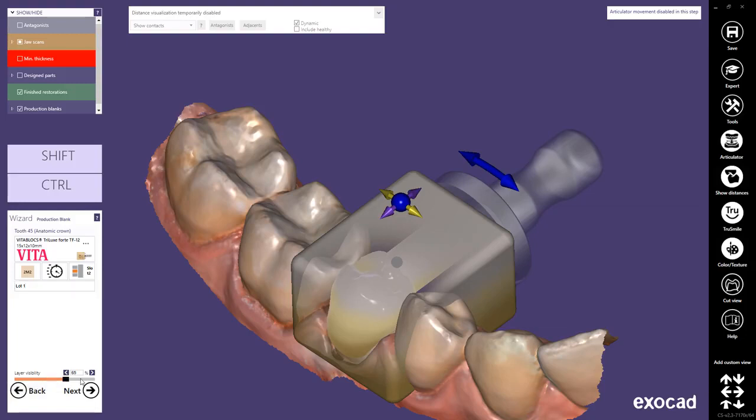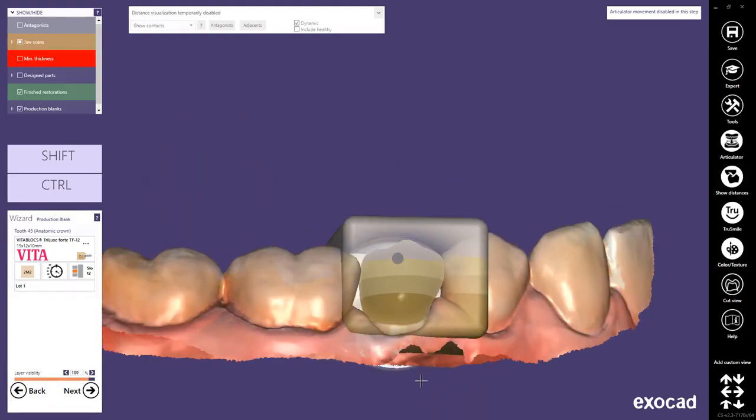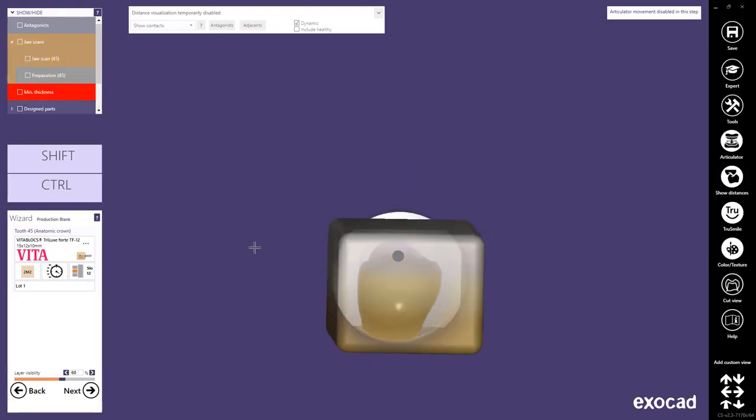Visual appearance of the layers can be changed. By using the InCAD, the nesting position and specification of the blank will be exported into the Construction Info file. Click Next to initiate the production step.